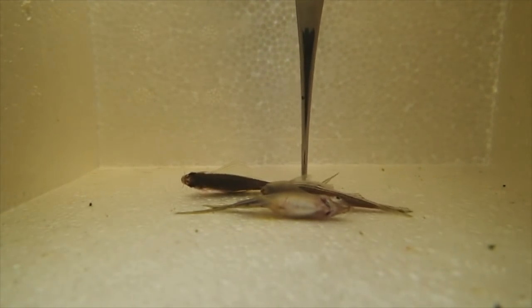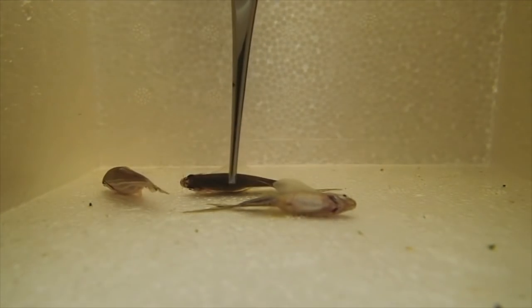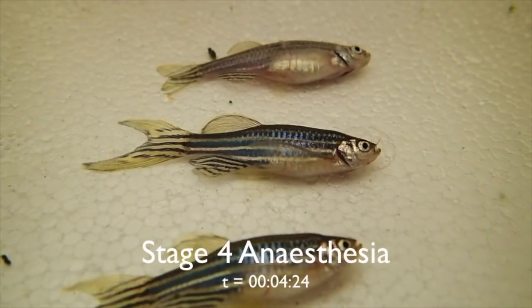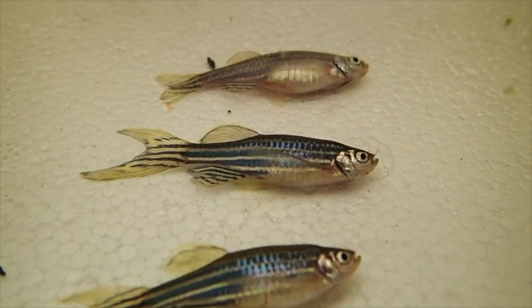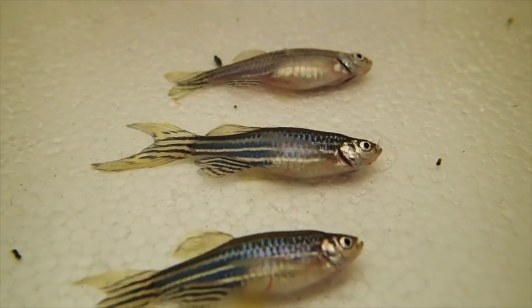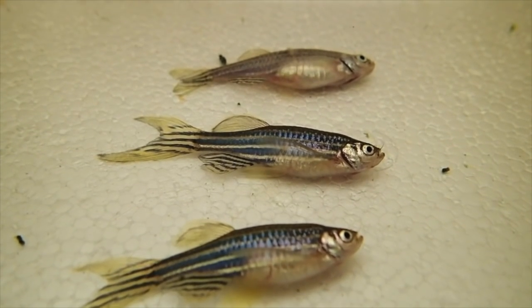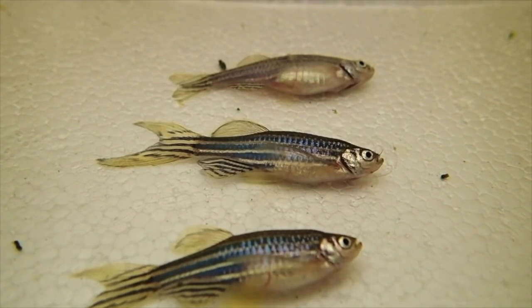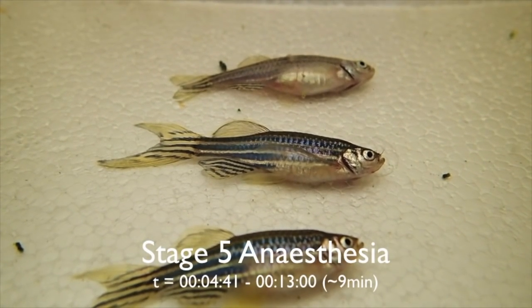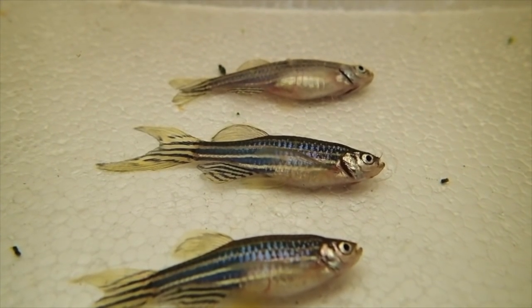You can see that there are still spinal reflexes at this stage, so we're not quite at stage 4 yet. But depending on what fish you have — like this one here, it's not reacting at all — so right now all fish are in stage 4 anesthesia. You can tell because if you provide some pressure onto its tail, you'll see that there is no reaction to the slight noxious stimuli being applied.